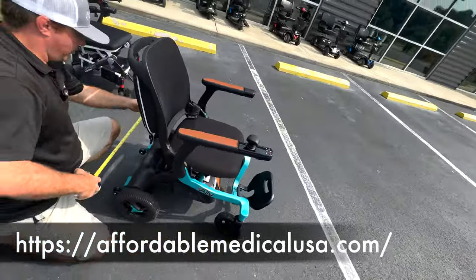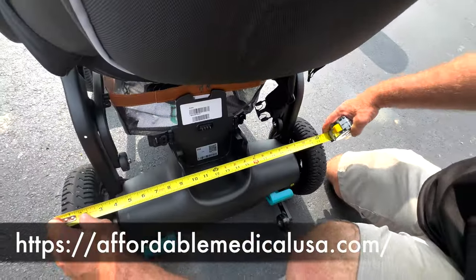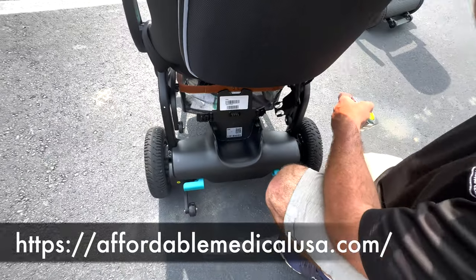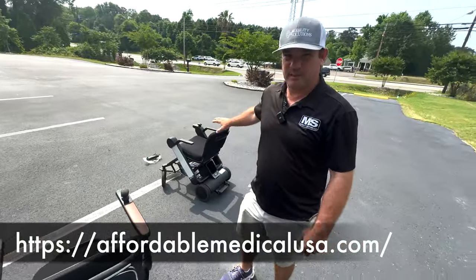Overall width at the wheelbase is 24 and a half, a little bit less than 25. So that's a big deal, guys. You might love this chair, but if you can't get it through your doorways, if you have small doorways, it might have to be something like that.